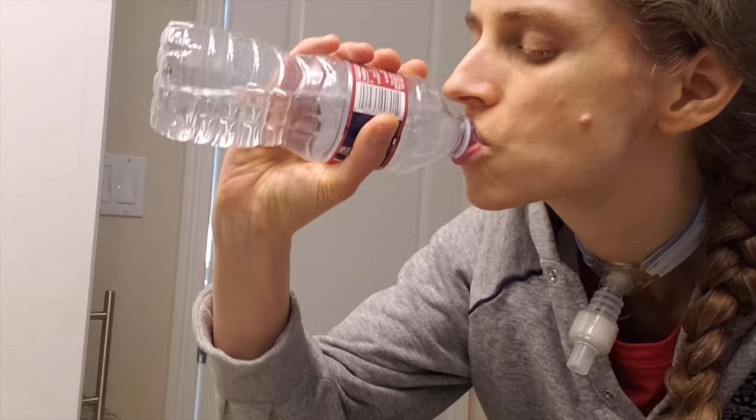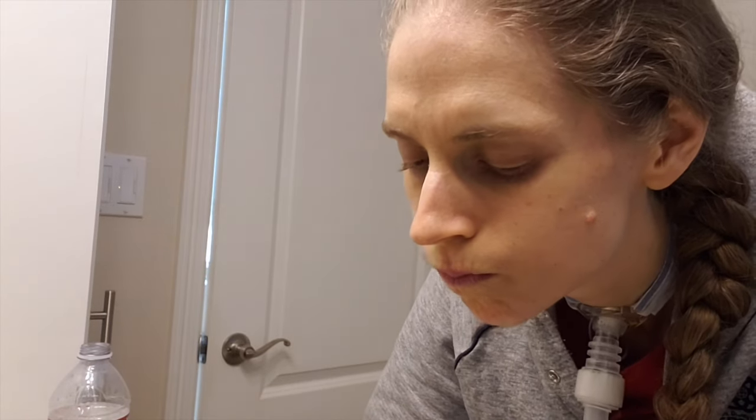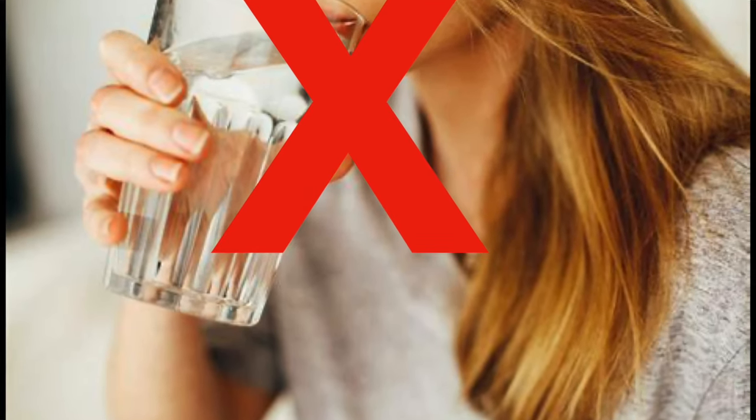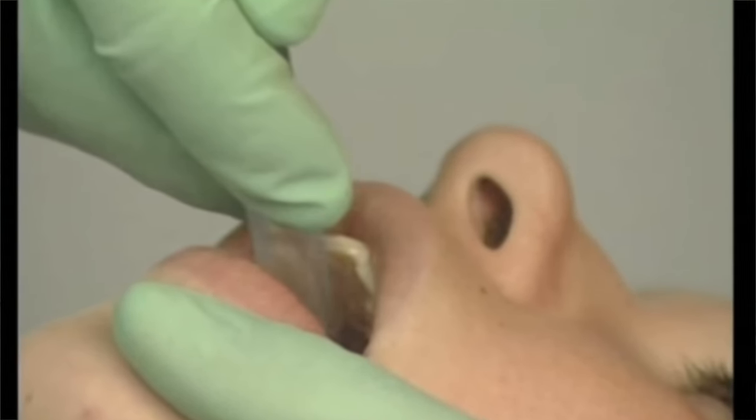After vomiting, a small amount of vomit and or stomach acid will remain in the mouth. Please rinse out the mouth with water several times to get rid of the vomit and stomach acid. If the person is not able to rinse out their mouth, please suction the mouth to remove any stomach acid or vomit.